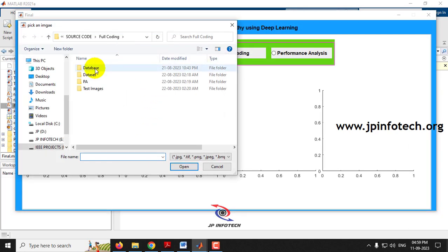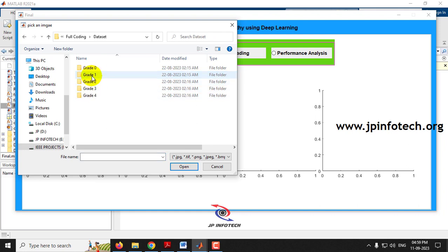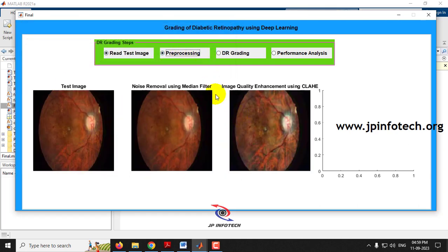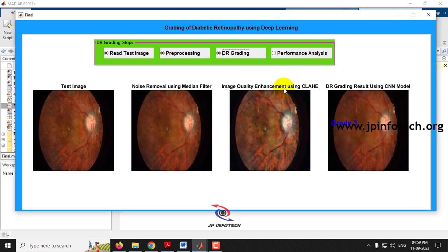Now let me demonstrate using an image randomly selected from the full dataset. Applying pre-processing and then DR grading, the result shows it is classified as Grade 3. You can check other images from both the test or train folders in the same manner.